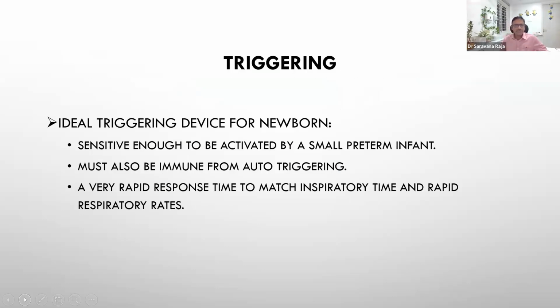So the ideal triggering device for a newborn should be sensitive enough to be activated by a small preterm infant, and it must also be immune from auto-triggering. A very rapid response time to match inspiratory time and rapid respiratory rate should be there.